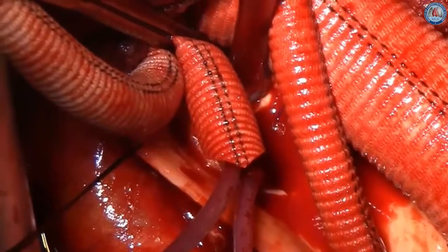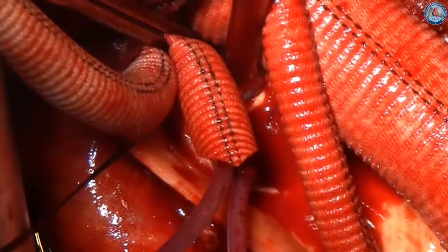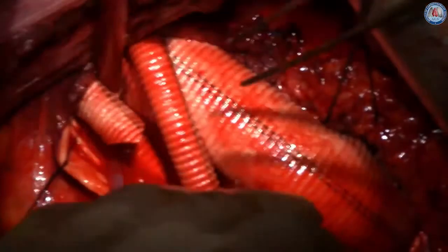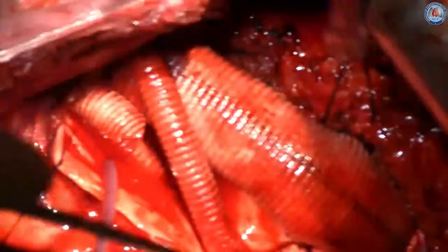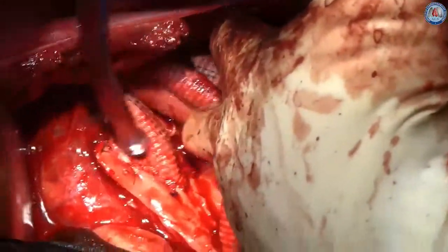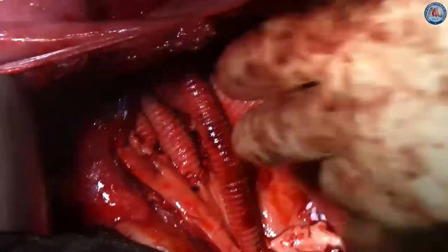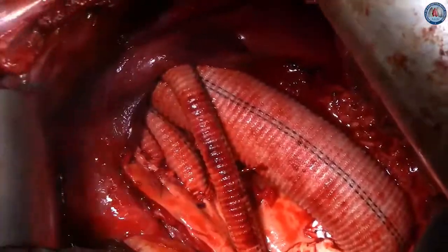Before completion of each anastomosis, the balloon tip catheters are removed and the grafts are adequately de-aired. This approach tries to minimize the actual ischemic time to each of the visceral and renal vessels. Although not depicted in this video, renal temperature is measured maintaining a temperature below 20 degrees Celsius.